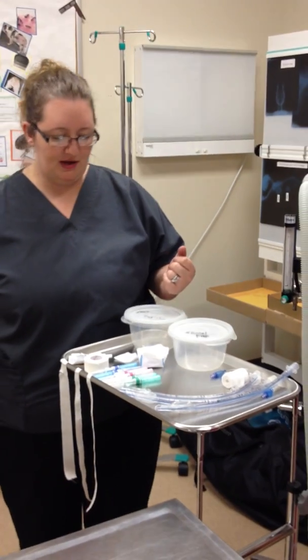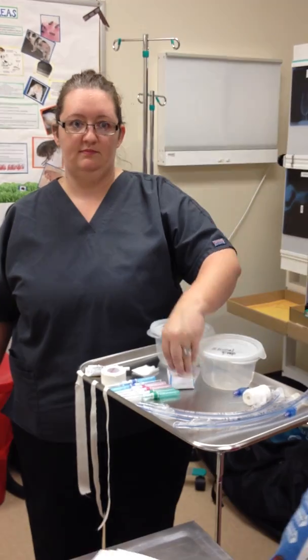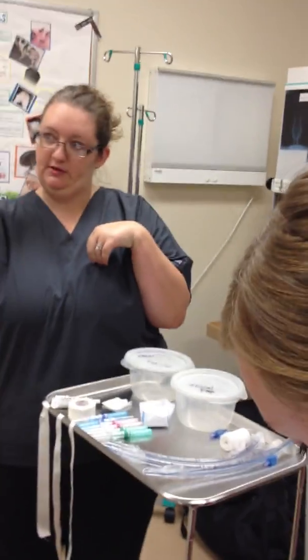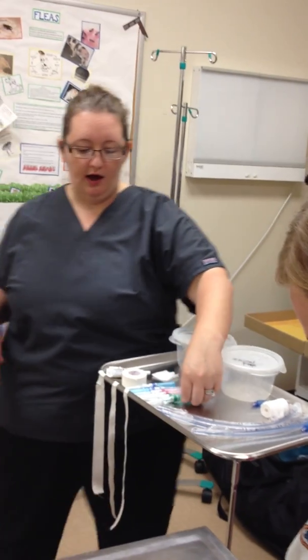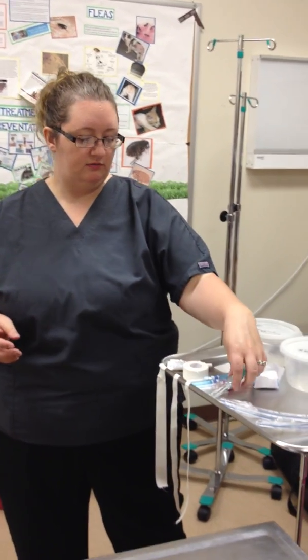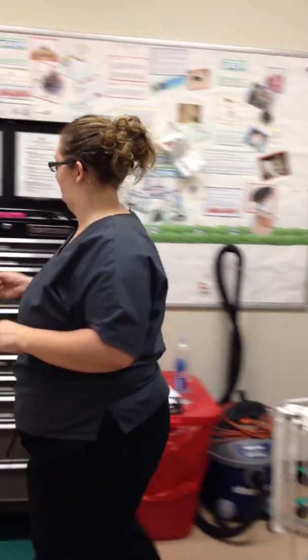As far as catheter sizes go, it's go big or go home. Why do we need a big catheter? Because if we need that vein access, we don't want to be waiting on a small little catheter for it to drip, drip, drip. Pretty much all your dogs are going to be 18s, and then your cats are going to be 20s or 22s. No 24s — 24s don't exist. Small dogs do receive 20s if they're tiny.